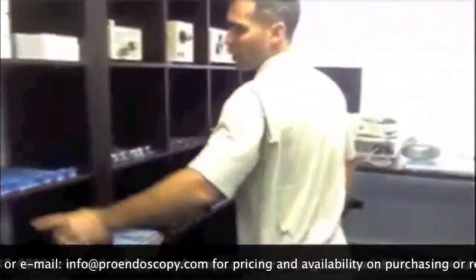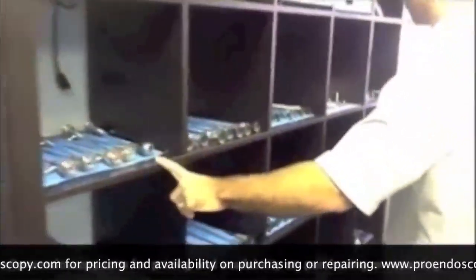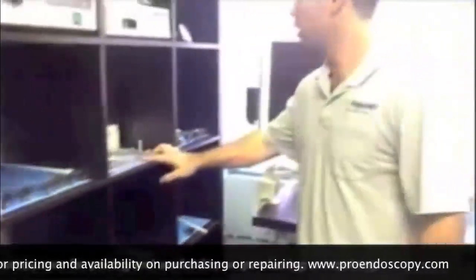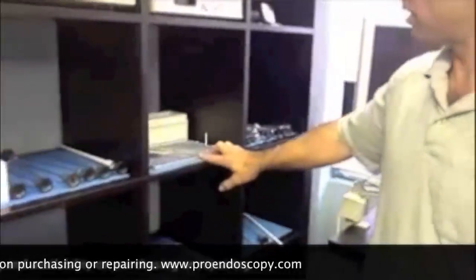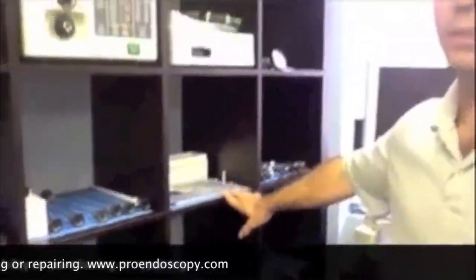We have some little arthroscopes here. We have plenty up here — we have another little set here for display. But we wanted to share with you what we have here in our office. So that's what we wanted to show you today.